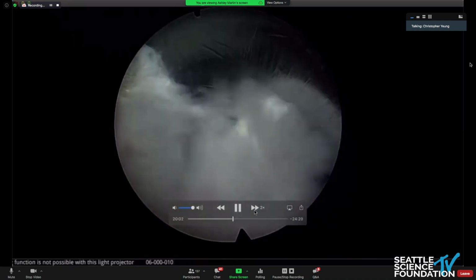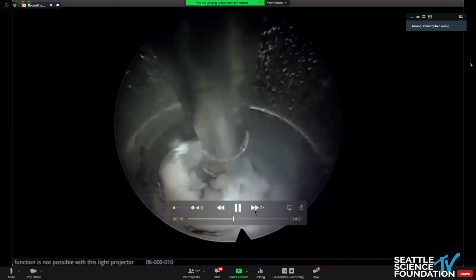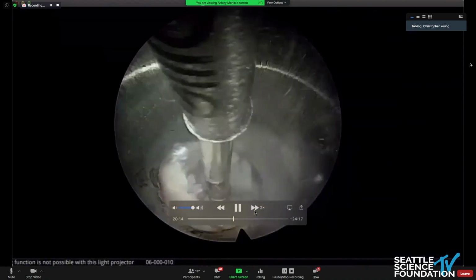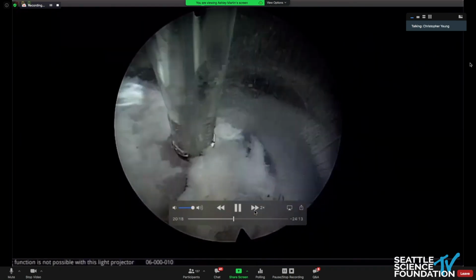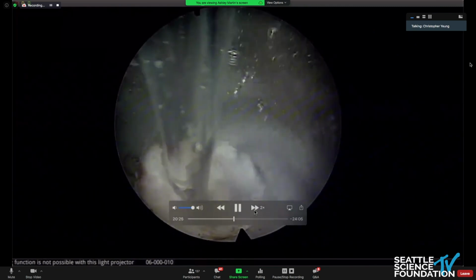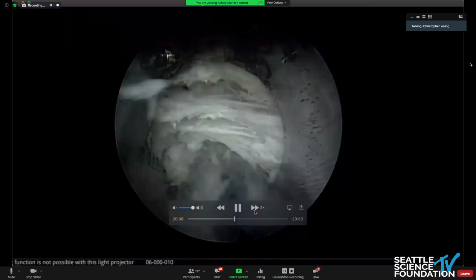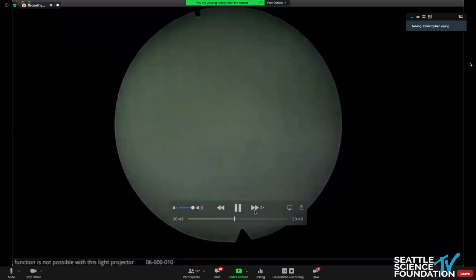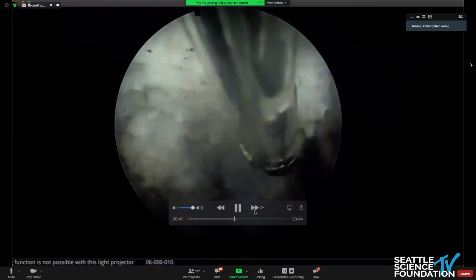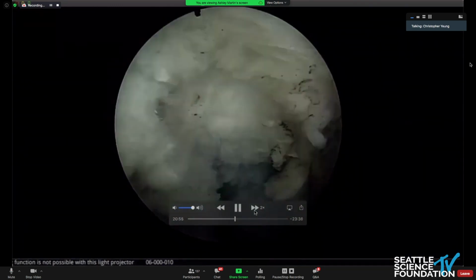That can often grab some bigger fragments that are harder to grab with the smaller pituitaries. Then I'll come back in and look around and correlate with the preoperative MRI, based on the size and location of the herniation you see on the MRI, and visualize that location and make sure that it's free of disc tissue.